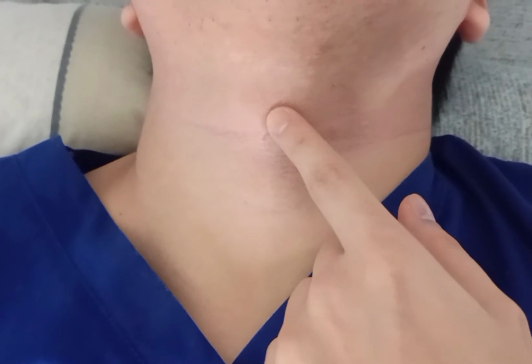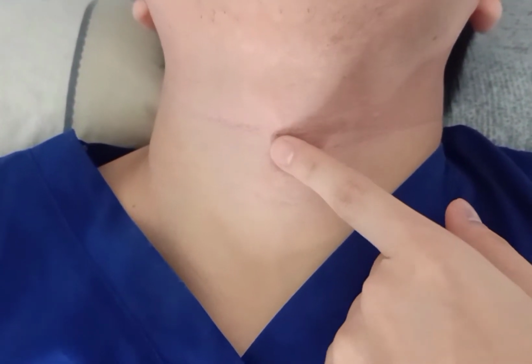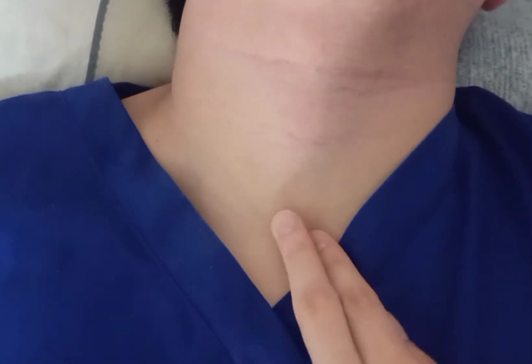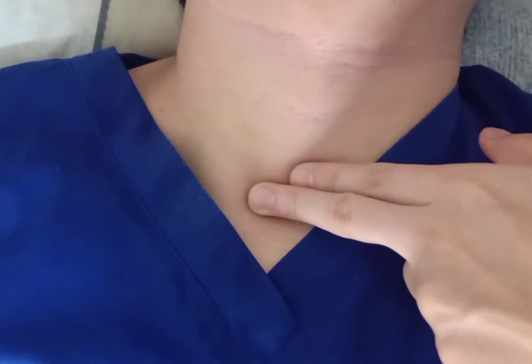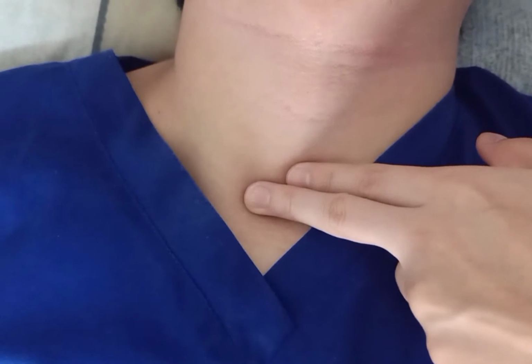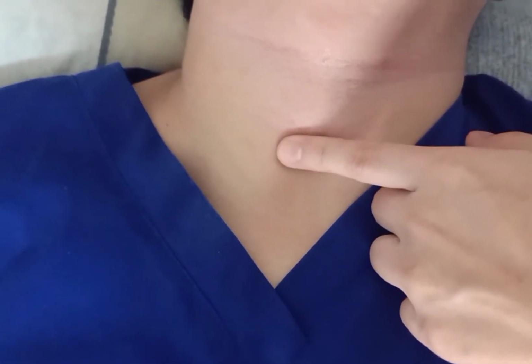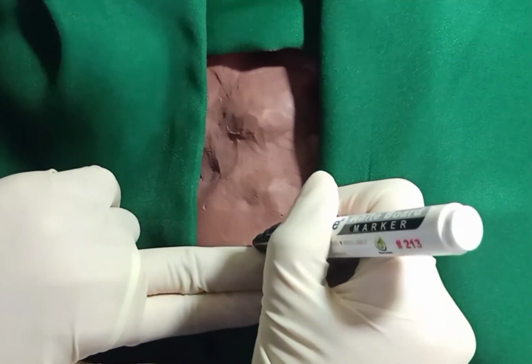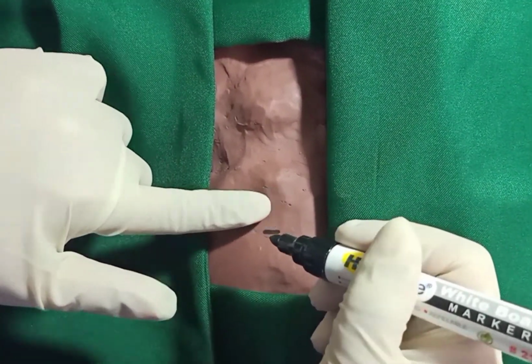Now identify the surface landmarks. First, the thyroid cartilage, then the cricoid cartilage, and in between is the cricothyroid membrane or the depression between the two cartilages. Also palpate for the sternal notch, and 2 finger breadths from the sternal notch is the incision site, which is also equivalent to 1 finger breadth below the cricoid cartilage. Mark the incision site 2 finger breadths superior to the sternal notch and the midline of the neck, which is also equivalent to 1 finger breadth inferior to the cricoid cartilage.